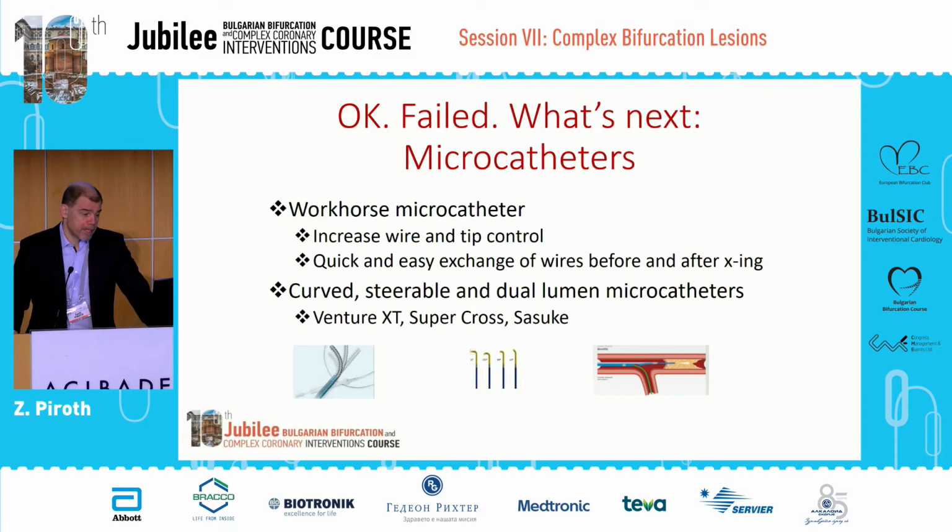If it fails, what's next? Of course, you have microcatheters on the table. You can use your workhorse microcatheters because they increase the wire and tip control. And of course, they make it easier for you and quicker to exchange the wire for either another wire or for the same wire to be reshaped and tried again.